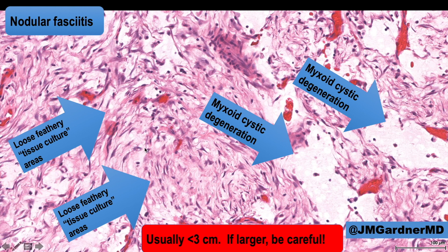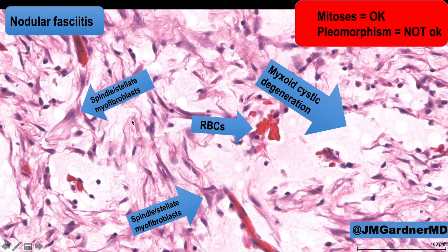Here's another example — this one is a little more pale due to the scan, but the myxoid change is sometimes not always as blue as in the first example. Again, loose feathery myofibroblasts, extravasated erythrocytes which are often present, and spindle, stellate, or triangle-shaped cells.